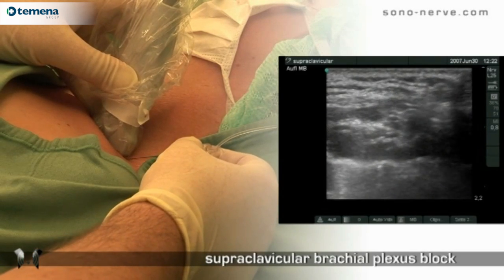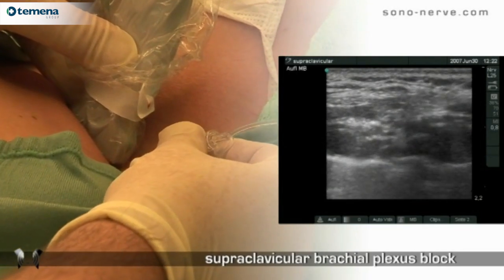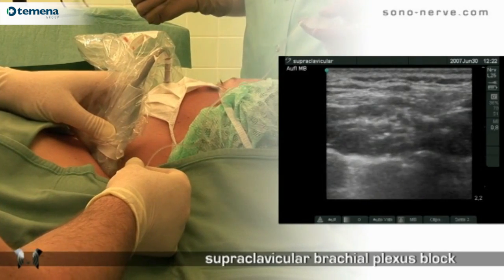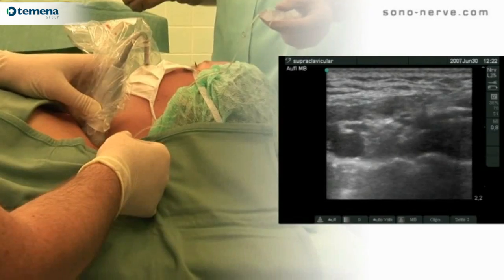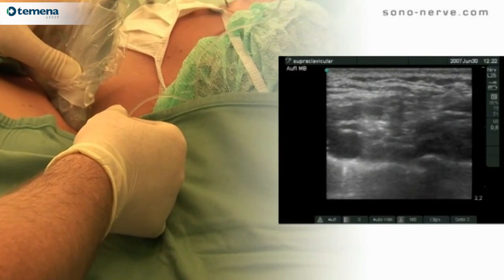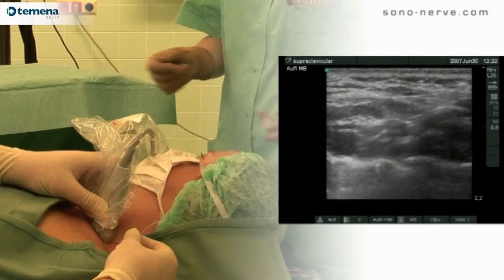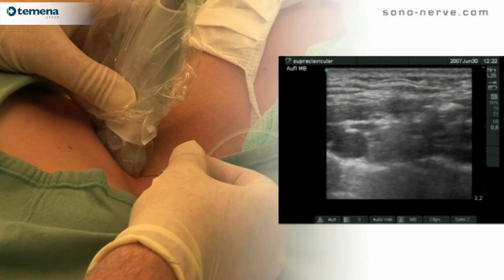This is one of the more challenging approaches to the brachial plexus. As you can see clearly on the ultrasound image here, the plexus lies in close proximity to the subclavian artery and the cervical pleura. The needle must be passed carefully from lateral to medial towards these structures but not into them.